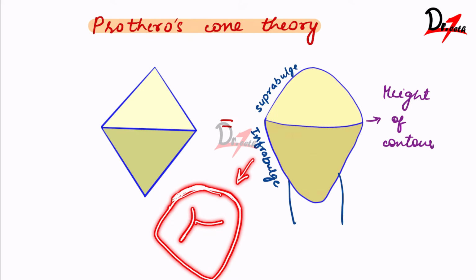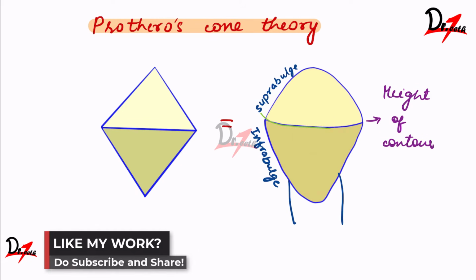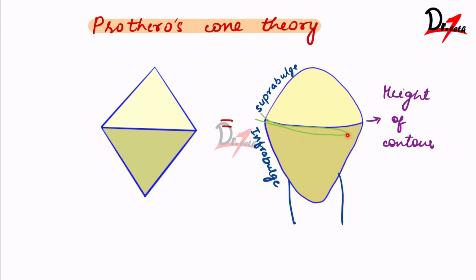You will place the prosthesis from the top. So it is very logical to understand that whenever we have a clasp terminus below the height of contour, since the diameter here is more than the diameter here, it will not be able to lift very easily because it is a metal after all. It cannot easily change its shape and lift. That is why we are getting retention, because we are engaging an undercut on the abutment.